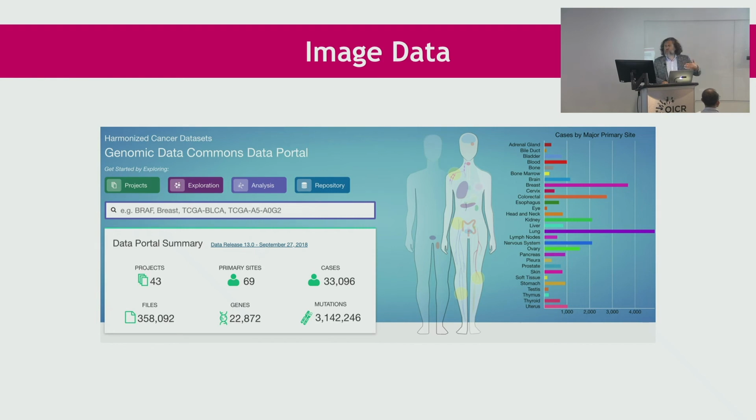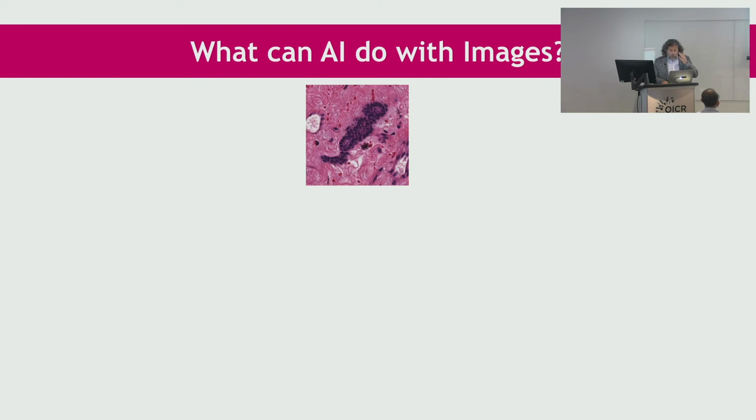Again, if you start from scratch and you're an average lab and you do 500, 600 patients a day as a small, let's say, community hospital, it will take a while to build up a data set. But there are publicly available data sets. So after you have the digital image, what is it that you want to do with it? With computer vision, and more recently with AI.